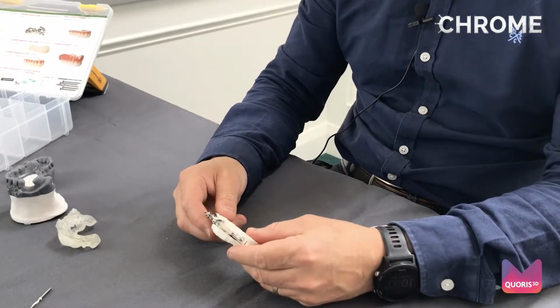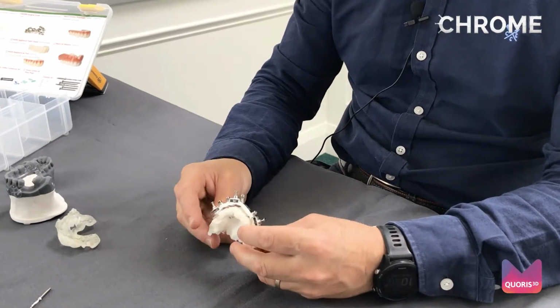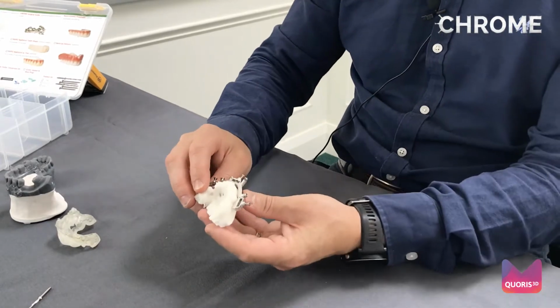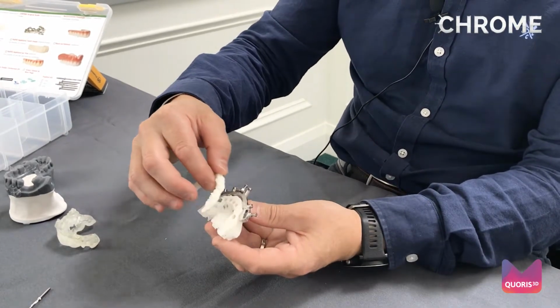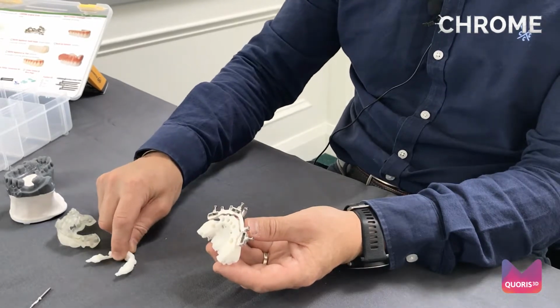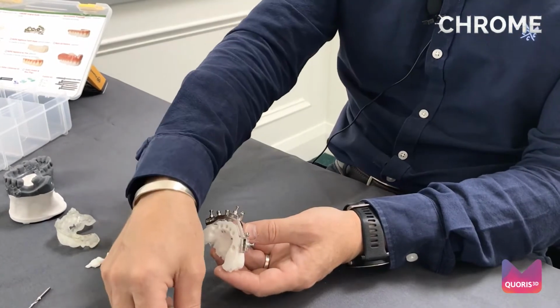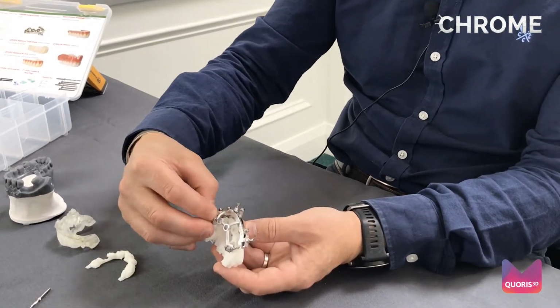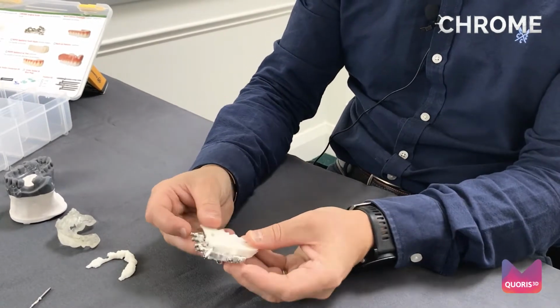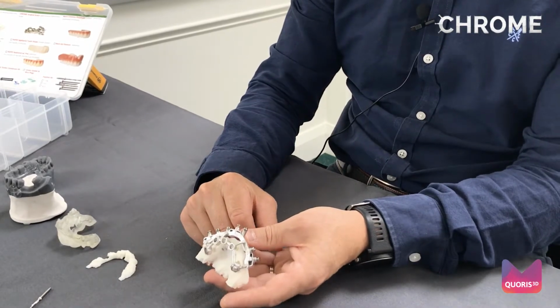Okay, so what we've done is we've simply transferred the fixation base onto the other model, just to demonstrate the bone removal or the bone reduction that has been planned. So the first thing that this fixation base does is allows you to guide how much bone is being removed. Again, this has been pre-planned. Once we are in this situation, the osteotomy guide is then attached again via the 3 Swiss locks. Very simple to do, and that's the osteotomy guide in position.